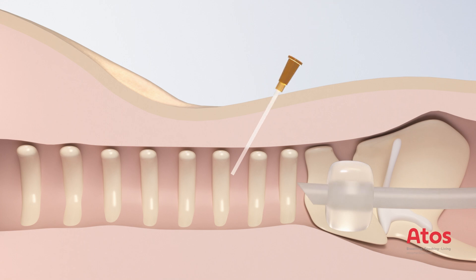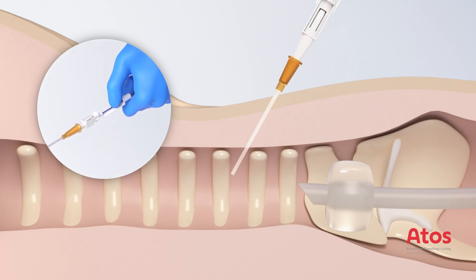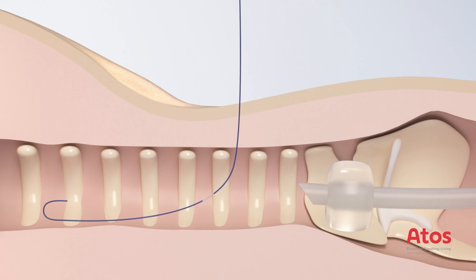After the air is visualized, freely remove the puncture needle together with the syringe from the Teflon catheter. Now insert the Seldinger guide wire by placing the introducer on the Teflon catheter and carefully push the guide wire through. The guide wire should be advanced up to its first marking, approximately 10 centimeters into the trachea.